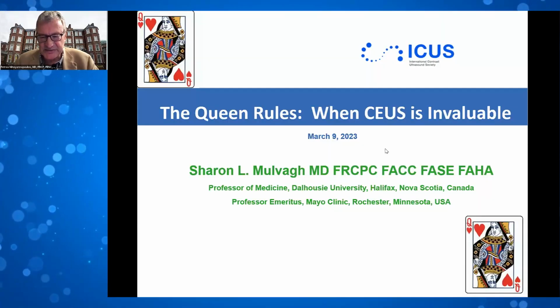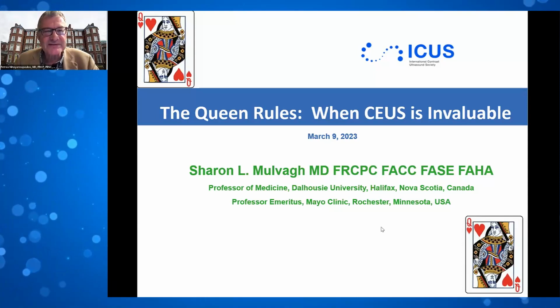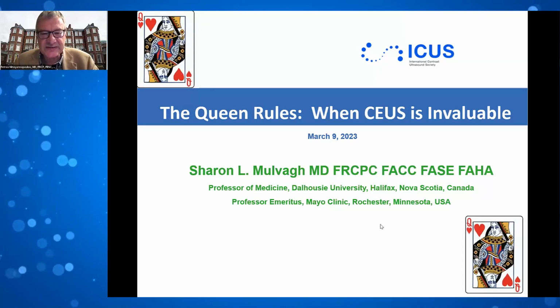Thank you very much. Thank you, John. Very, very nice. You covered a lot of issues concerning the use of contrast in daily clinical practice. Not sure I can see any questions. Probably you answered already all questions that people were supposed to ask.